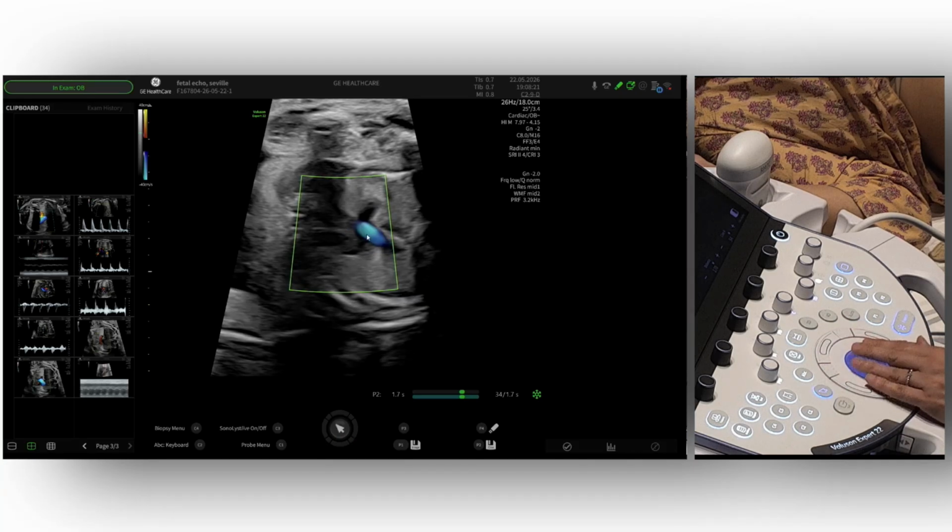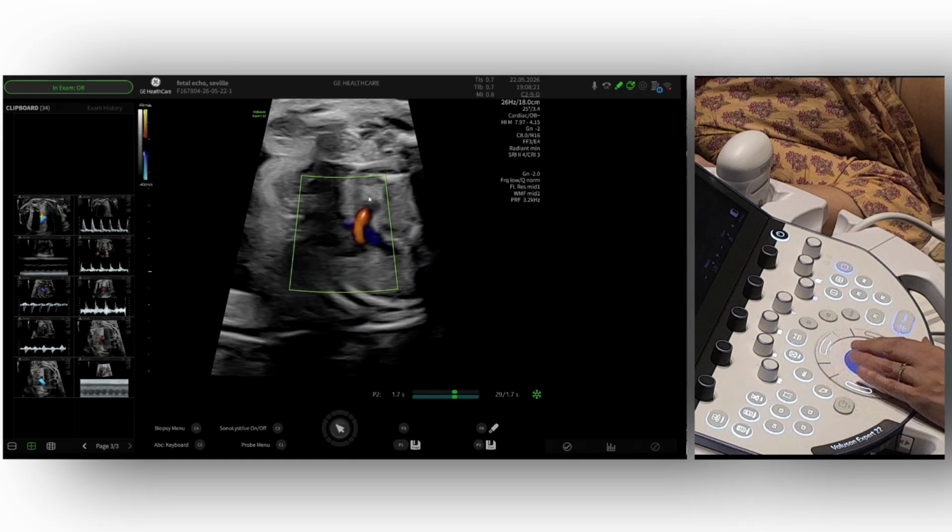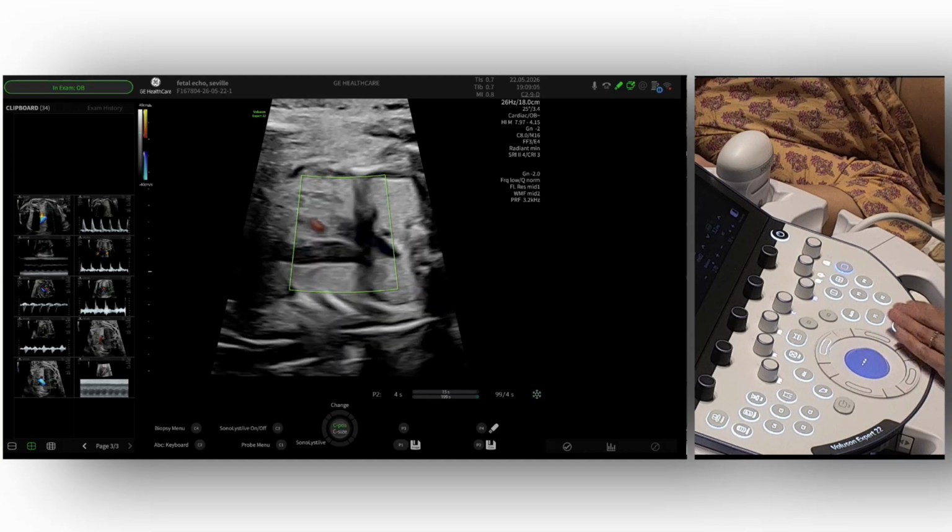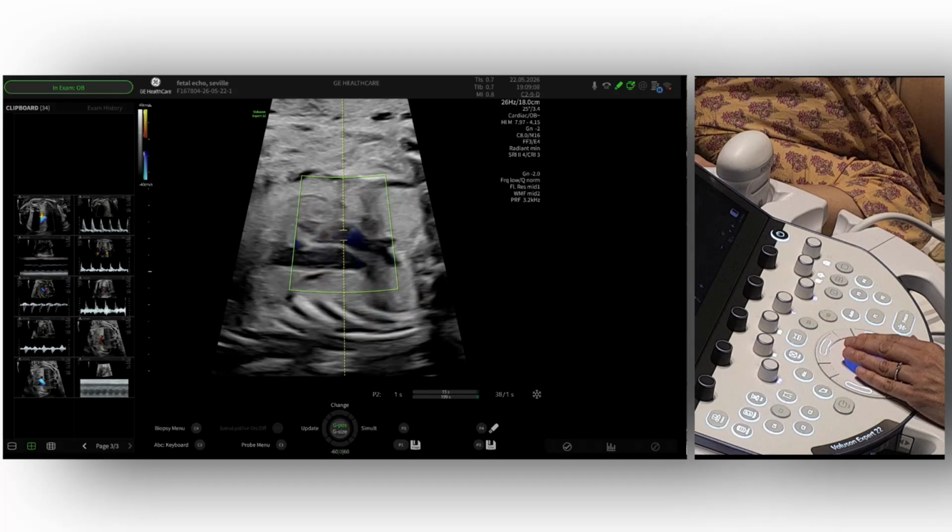This is pulmonary artery, aorta, superior vena cava. And then, you see that here? So this is the innominate vein. So it's a vein that goes crossing before, no? So that would be the V, so before the V, and it's a vein that crosses and goes to the superior vena cava, yeah? So if we manage to get at the same time, you see that we can manage to get at the same time the aorta, that here it's in blue, and this innominate vein that here is in red. So if we put the Doppler here, we will manage to get again the atrial and the ventricular flow.